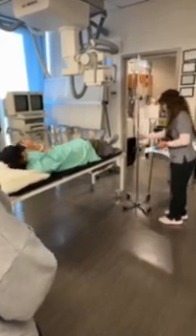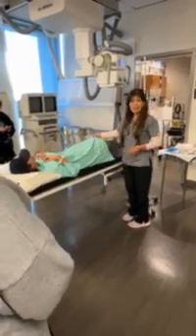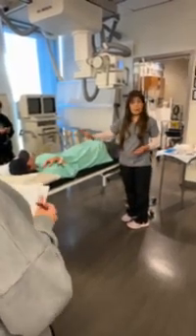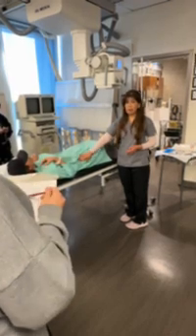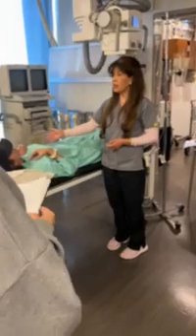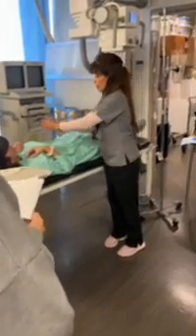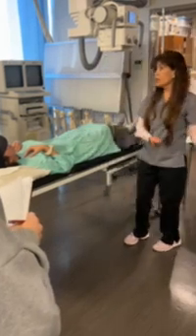I'm already here. The first thing I'm going to do before the injection and everything is take a scout film. So my first scout will be a KUB normal: kidneys, ureters, and bladder, right? And then my second scout will be a cone down of the kidneys specifically. So I do 2 scouts, 1 full and then just 1 with the kidney centered. I go show it to the radiologist.